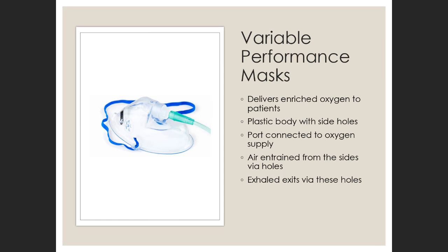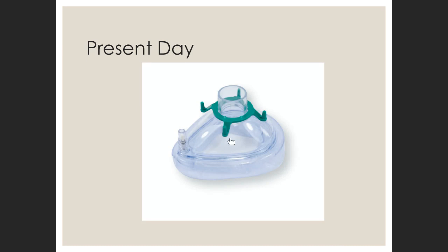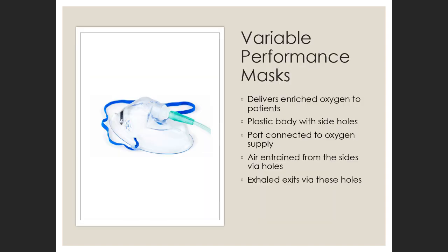Good job. All right, you do have some other masks. So these are the anesthetic masks. These are the ones, when fitted properly and attached to an appropriate anesthetic oxygen delivery system, we can give 100% oxygen to the patient. Yeah, once the seal is excellent. All right, so then you have what we call just ordinary face mask. Everybody has seen this? Maybe if you've been a patient in a hospital, you have.